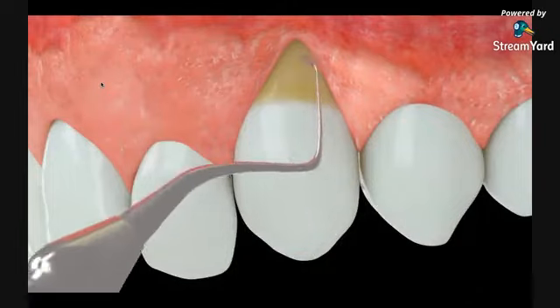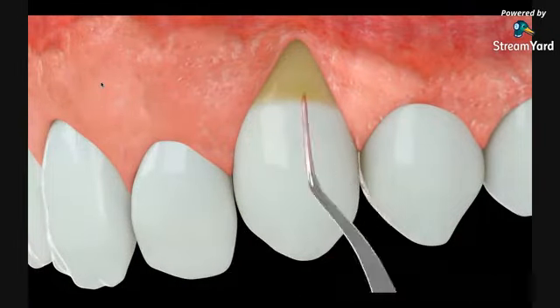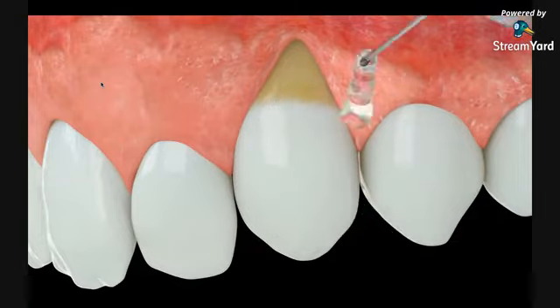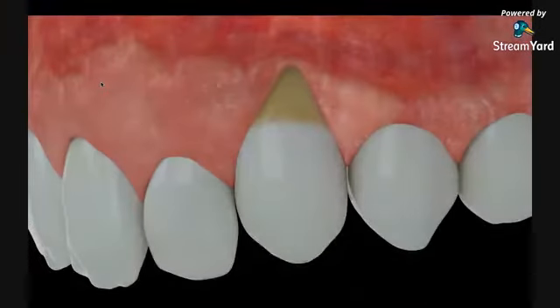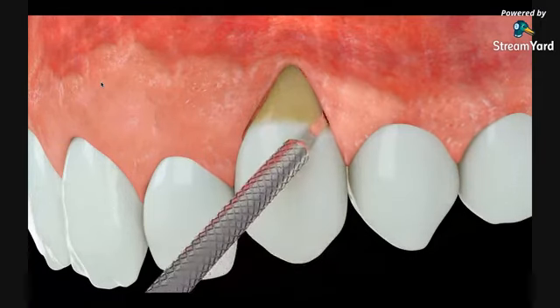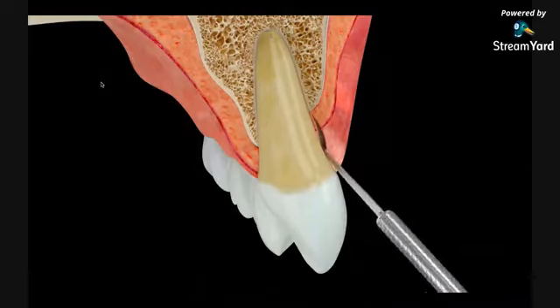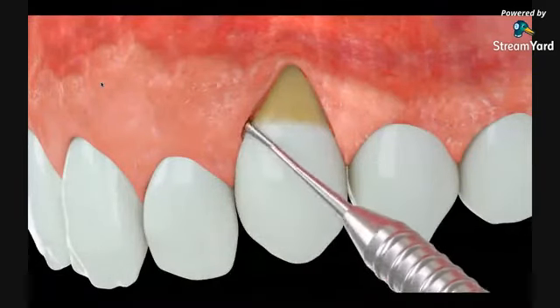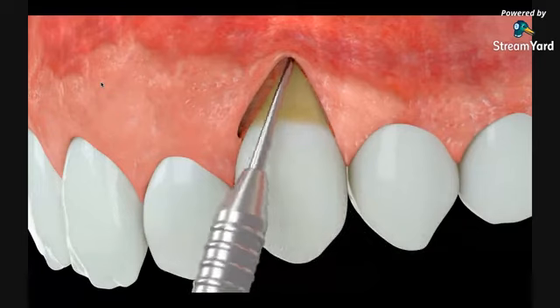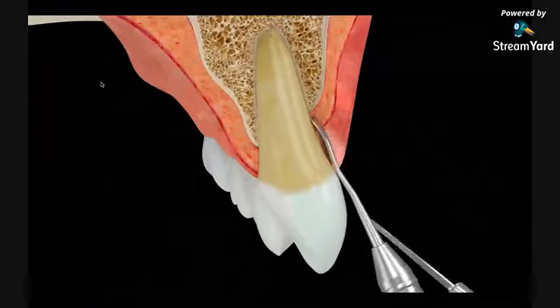So this is what we're doing now. You need to clean the surface. You need to use a saline solution. You need a very thin scalpel. Here I'm using the 69 blade. I'm using a partial thickness flap to have this bilaminar blood supply. Here I'm using a tunneling knife, TKN1.